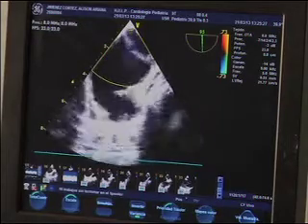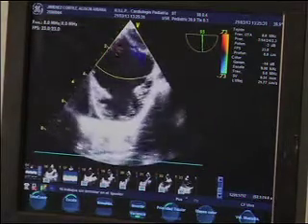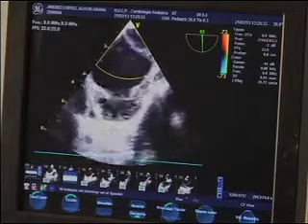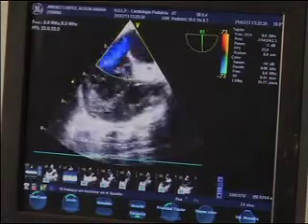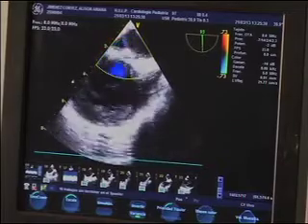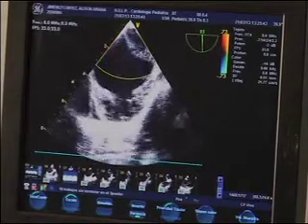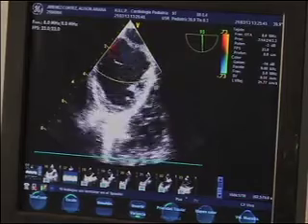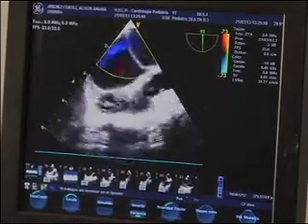We need both fluoroscopy planes and the echo plane, the echo view. I have found another place in the echo, but I don't like it at the fluoroscopy. Yeah, I think we just have the TV camera in the room to work with.